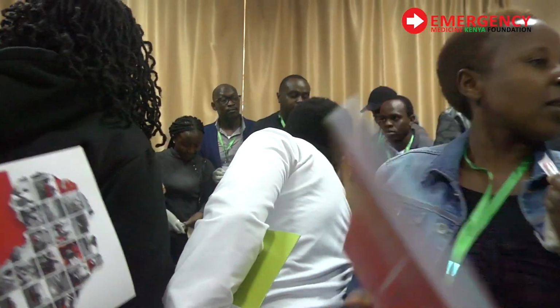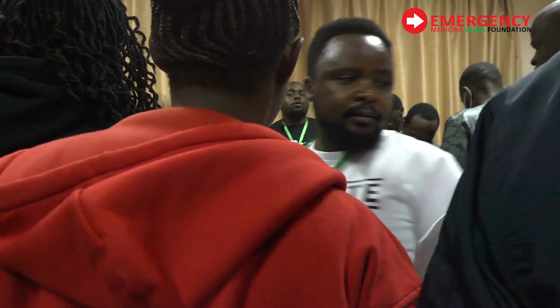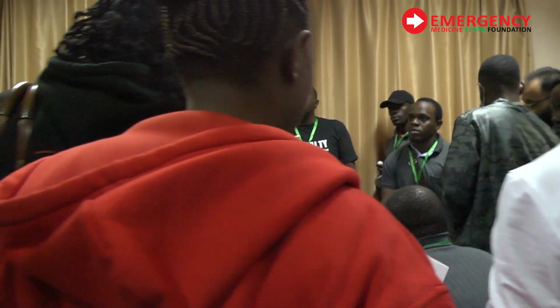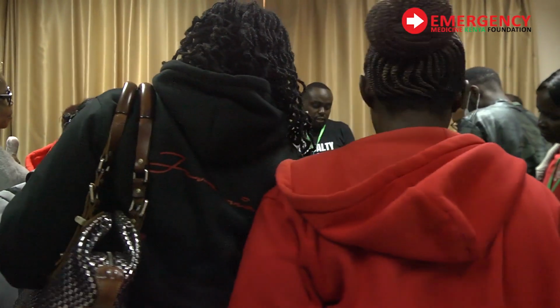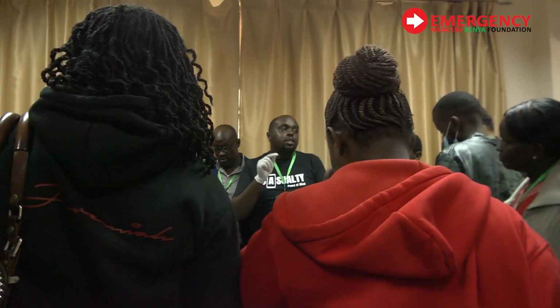I like the enthusiasm, everybody wants to practice. Somebody has asked a question. Please let's answer this question, then you can practice. The question is, for how long do you want that intraosseous access to be there?